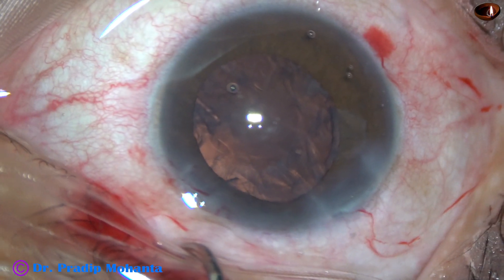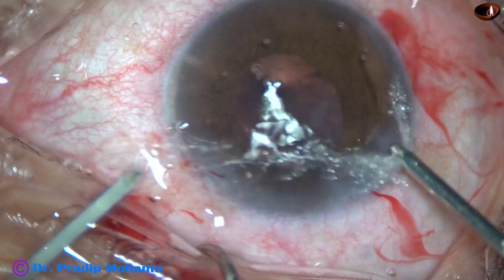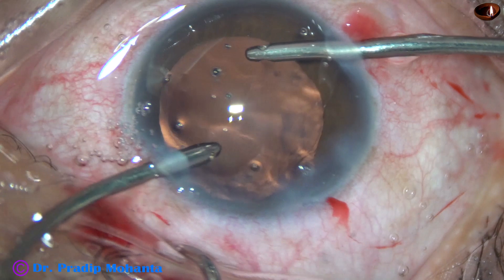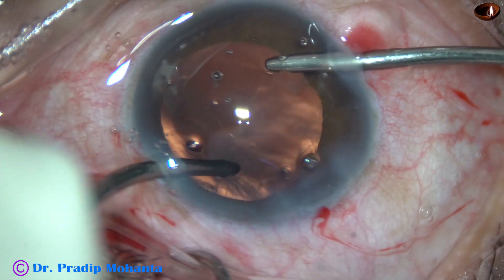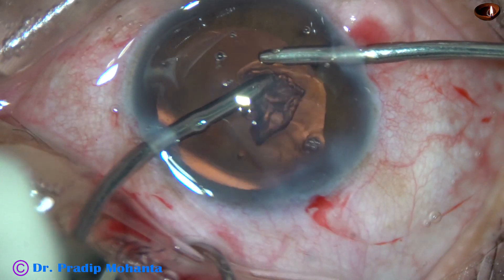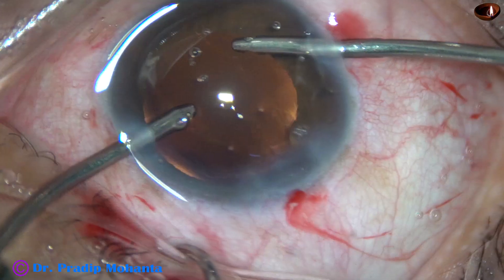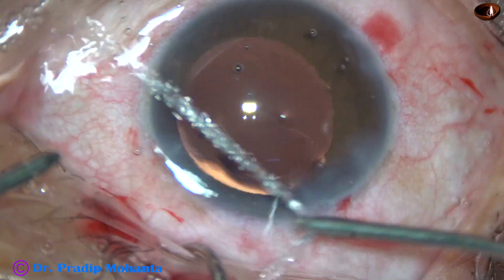Now I started cleaning the cortex. I used bimanual irrigation-aspiration for the upper part, and for the lower part I used a Simcoe cannula.